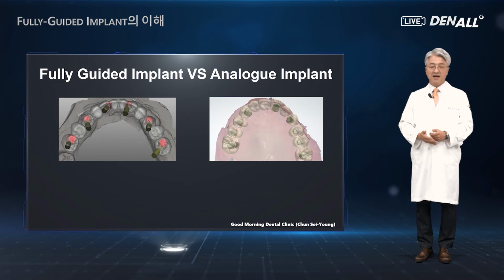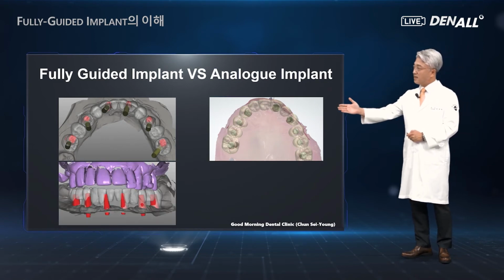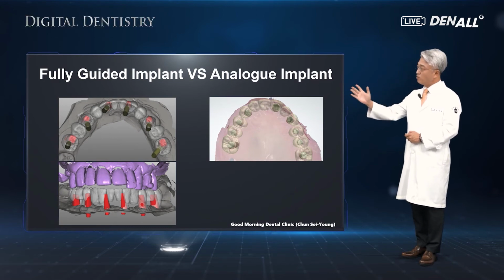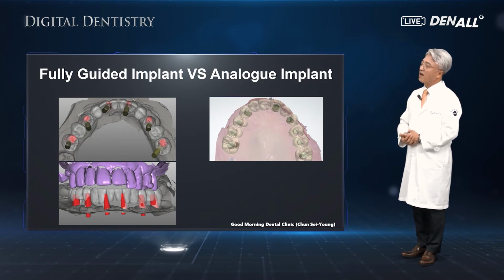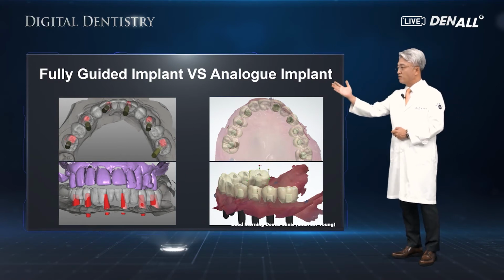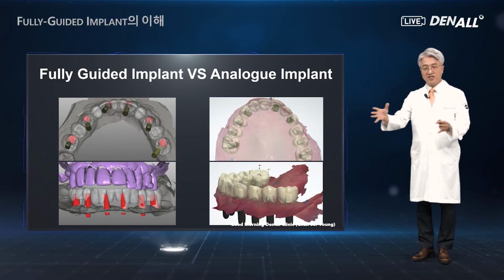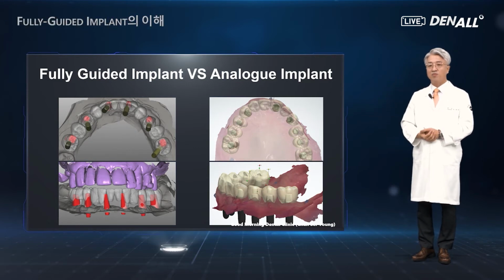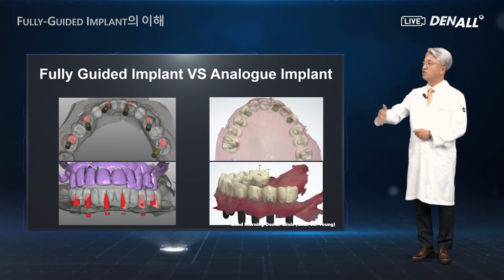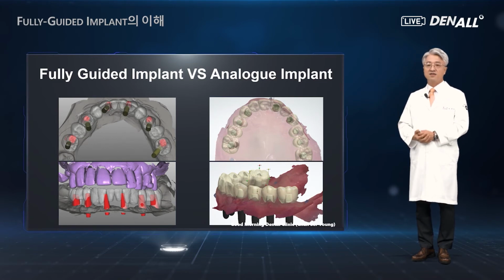In the anterior region, abutments are placed between teeth, and there were difficulties in the lab work to overcome that problem. But using the Implant Studio, in advance, using the top-down approach, the design and the fixture positions are designed, then the problem can be minimized. A more aesthetic and natural tooth-like appearance can be achieved, and the relation between the prosthesis and gingiva looks very natural.